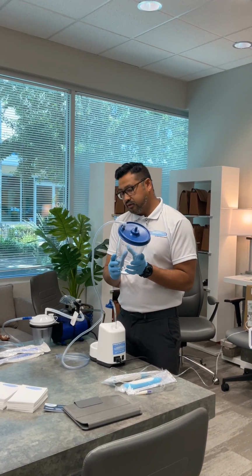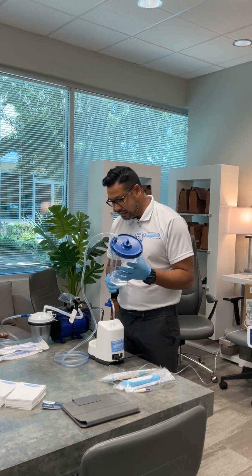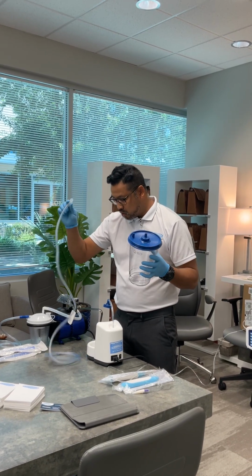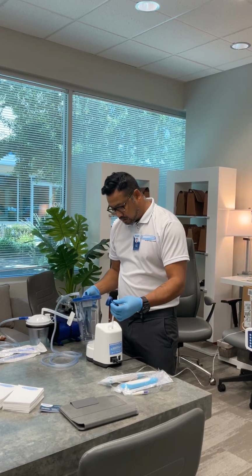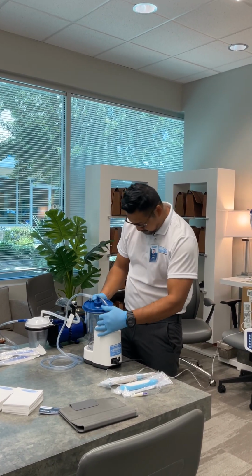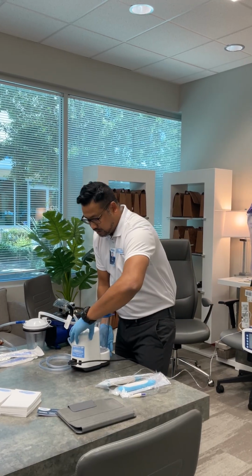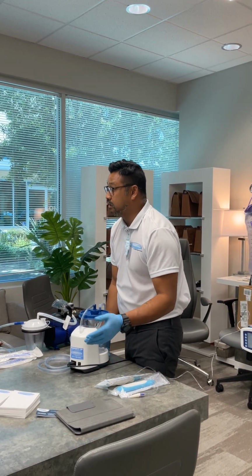There is a collection jar right here. There are some tick marks, and it goes up to 2,000 cc's. There is a hose that goes towards the patient, and then a little hose that attaches to the center of the canister right here. On the back, there's an on and off button, so you turn it on overnight and you just forget about it.